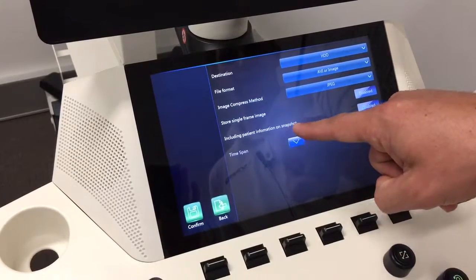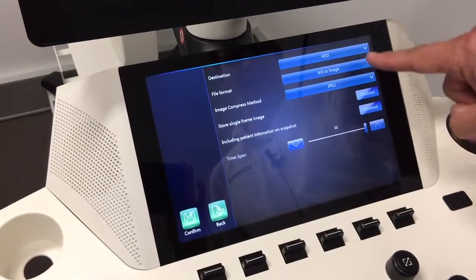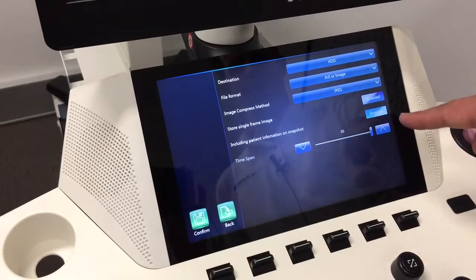Include patient information on the snapshot. At the moment it's disabled. If you want to have your patient details there for your AVI and JPEGs, you just hit enabled, and then when you save the image and replay it, you'll see their patient details.